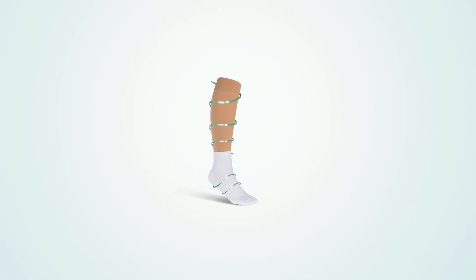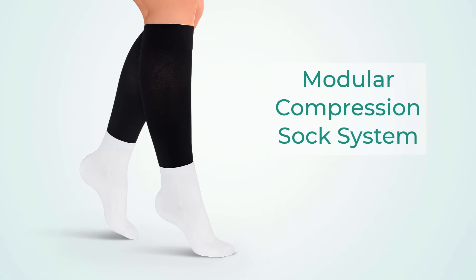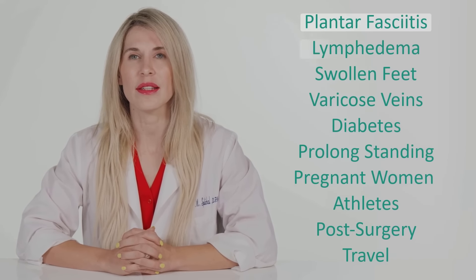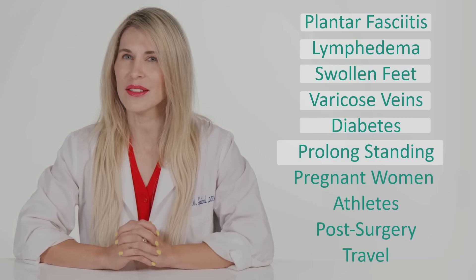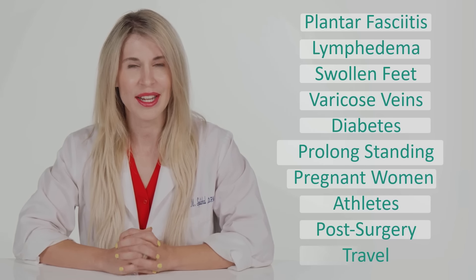This helps maintain blood flow, reduces swelling, and enhances comfort and performance. This unique modular system allows you to choose different colors in the ankle sock and the calf sleeve. OrthoFeet's innovative compression socks are ideal for plantar fasciitis, lymphedema, swollen feet, varicose veins, diabetes, people who stand all day, pregnant women, athletes, post-surgery, and travel.